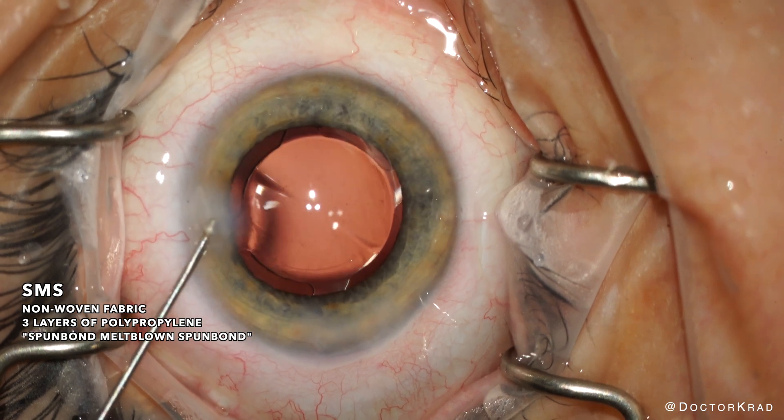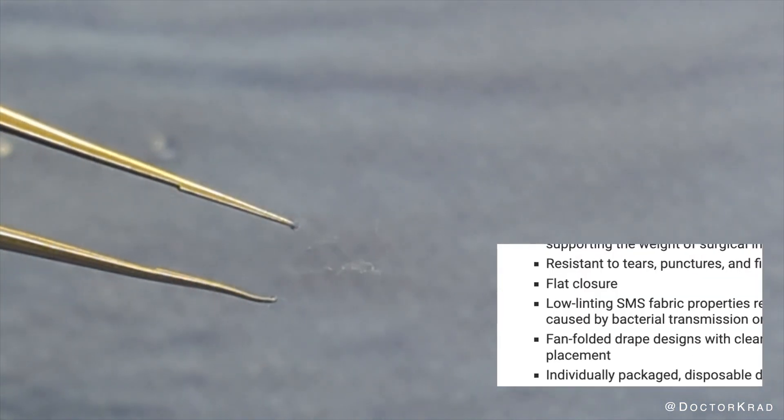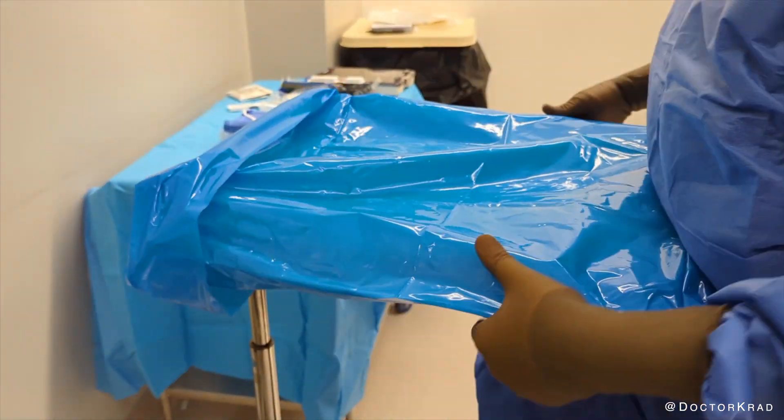SMS is strong, durable, and has excellent barrier properties. Although they say it's low lint, it sure doesn't feel that way. These fibers are too commonly found on surgical instruments. Even though they're sterile, I'd rather not have any fibers or lint left in the eye.